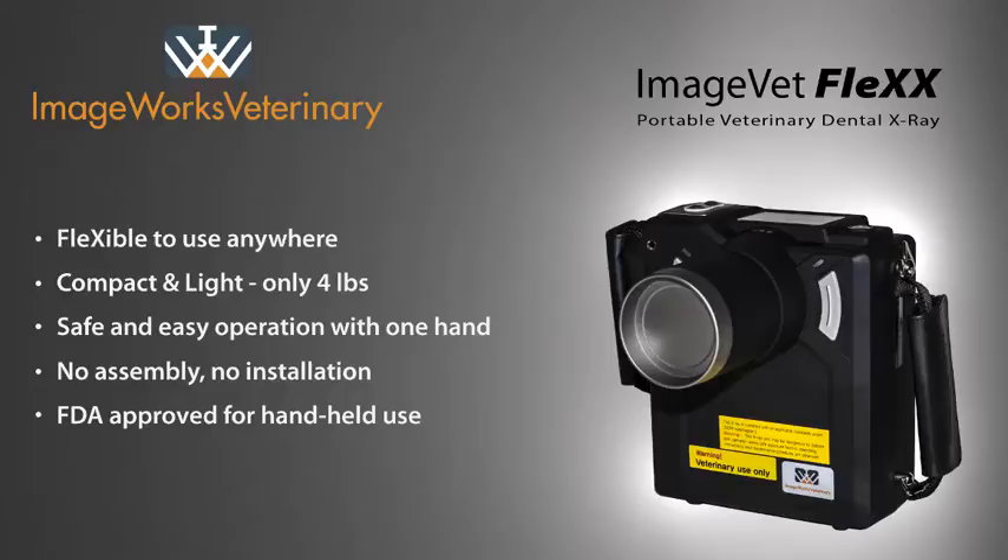Hello, today we'll be demonstrating some of the key features of the ImageVet Flex, the new portable dental x-ray generator from ImageWorks Veterinary.